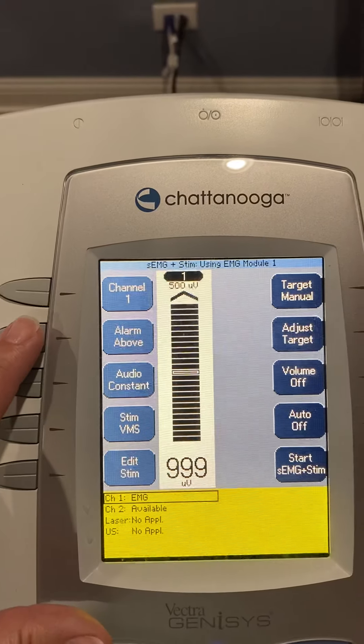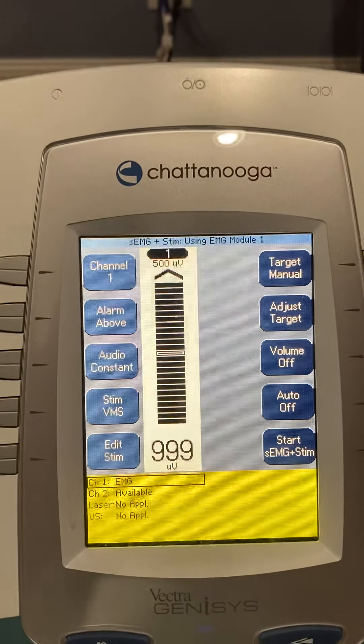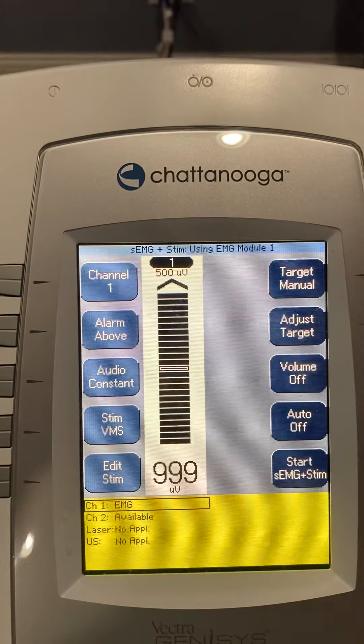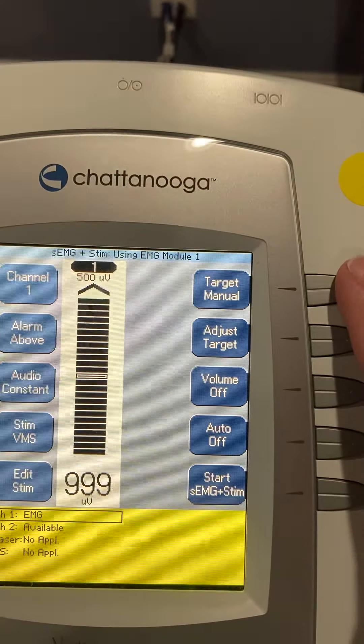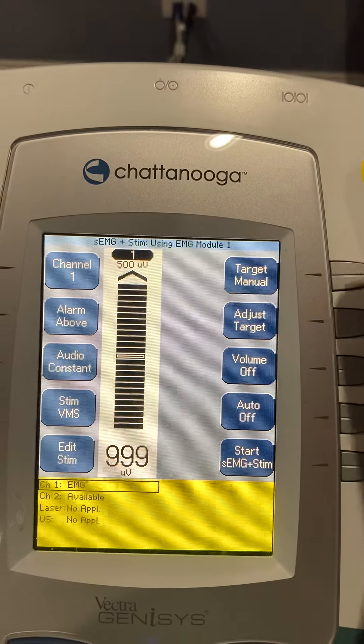For strengthening, we want the patient to activate as many motor unit action potentials as possible — think of it as having them fire as many muscle fibers as they possibly can. We're going to have to capture our target, and we'll do that as soon as we get the patient set up.